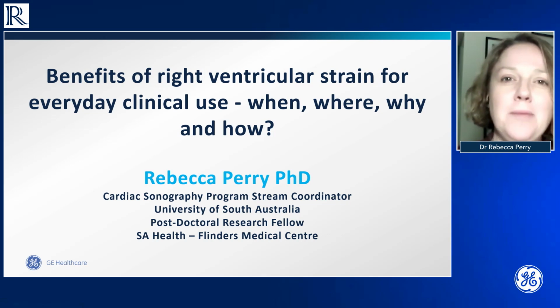My name's Dr. Rebecca Perry from Adelaide in South Australia, and it's my pleasure to talk to you today about right ventricular strain and the new AFI RV package from GE. A big thank you to GE for the opportunity to talk today.